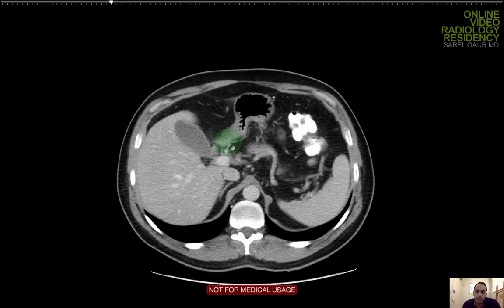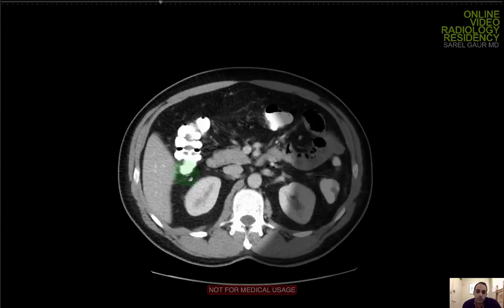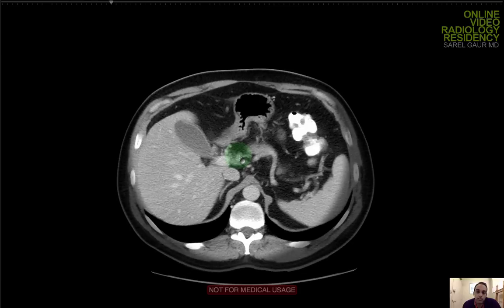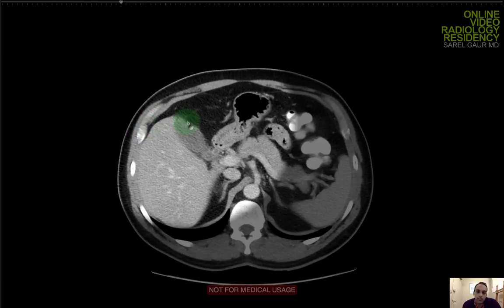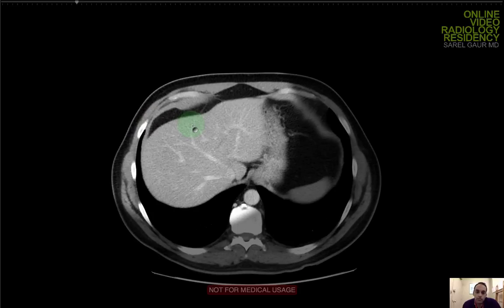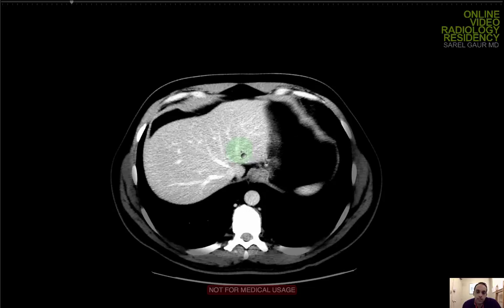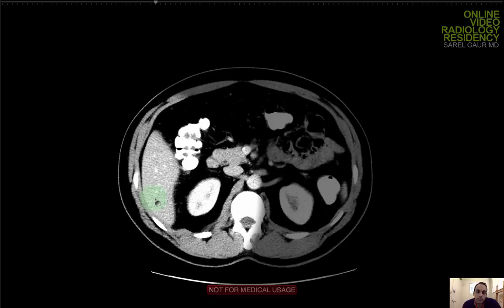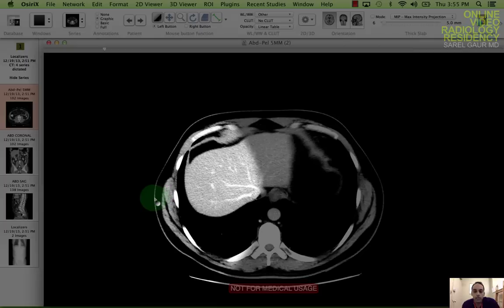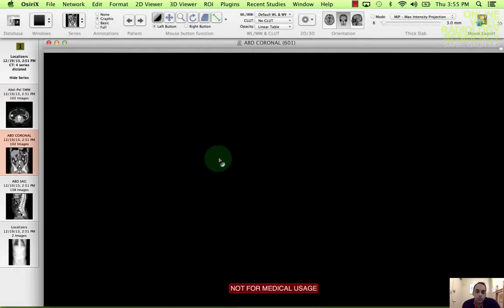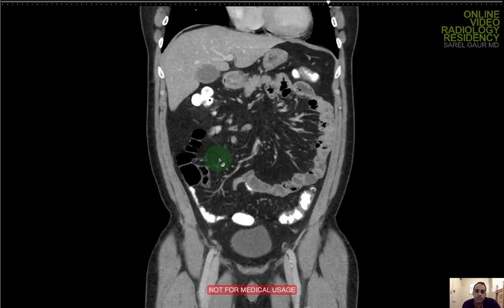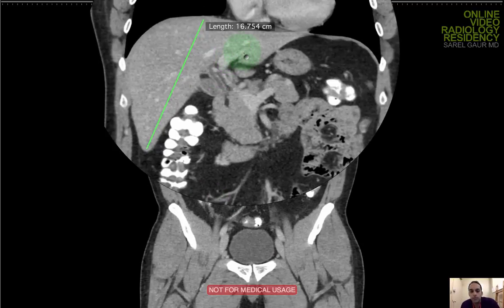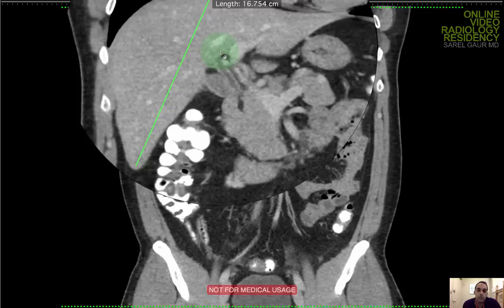Now we're going down to the abdomen. The first thing I'm going to do is look at the liver — looking for homogeneity, focal lesions, and the liver contour, like in cirrhosis. I'm not seeing anything. I'm going to narrow the windows, looking at the left lobe and right lobe for any focal lesions like an abscess. I'm not seeing anything. Flipping to coronal: the liver size is 16.7 centimeters — normal size, no hepatomegaly.